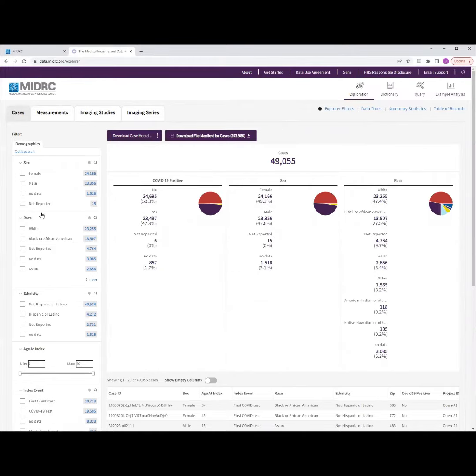Finally, on the left side of the screen are the patient and imaging characteristics that allow us to filter data to create a cohort for a specific research question.